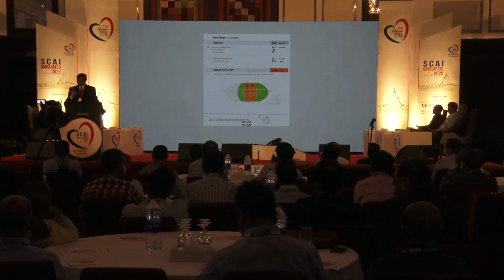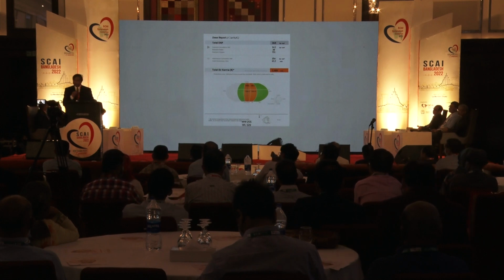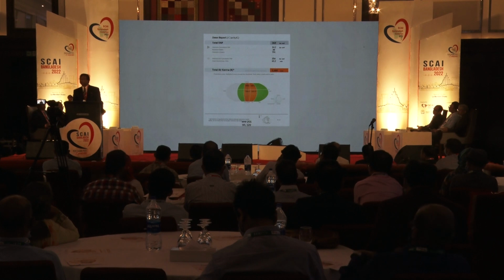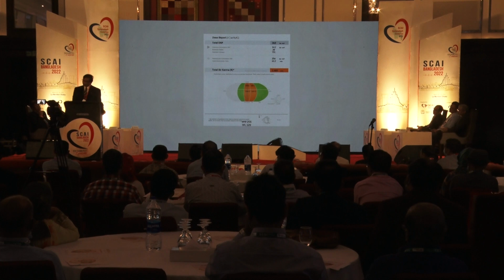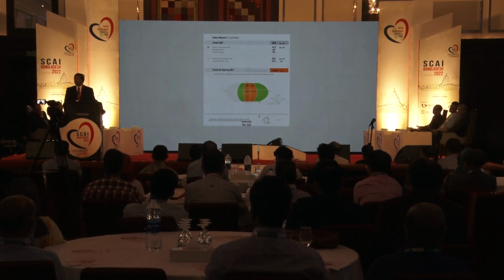And I think when I used the Godzilla and Godzilla not working, at that point, I was really upset with the fellow. He said, "Did you look at the radiation dose?" And I said, "Oh, that's not good." So now we have to make a prompt decision. You know, like, when the captain sends the regular batsman, he sends somebody who is a high hitter, and then finish the innings. So what do you do now?